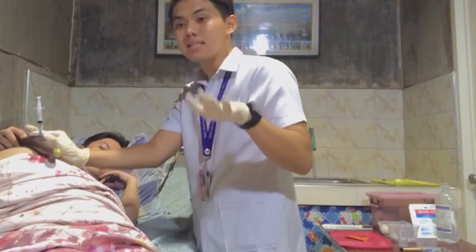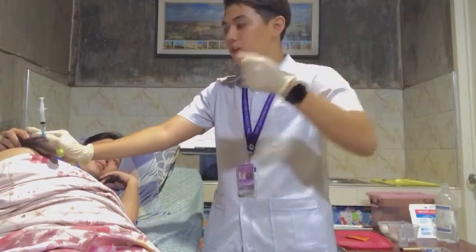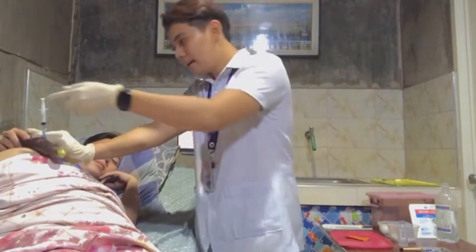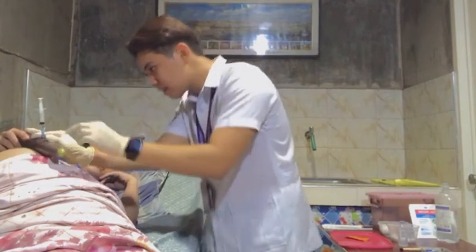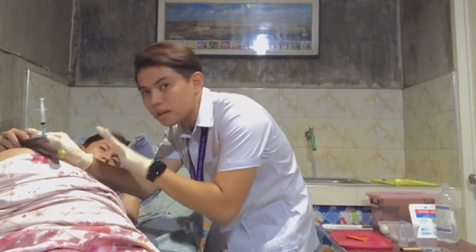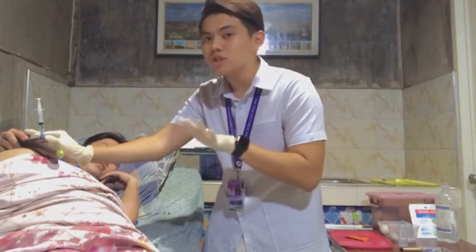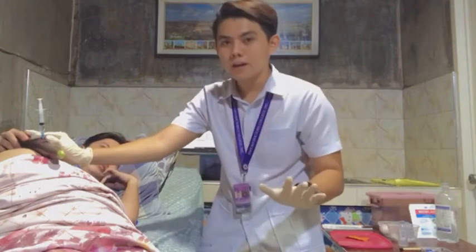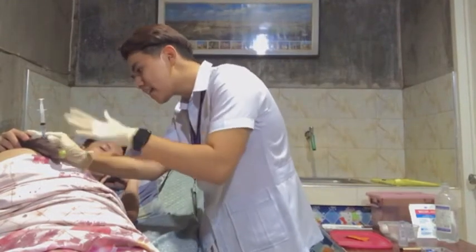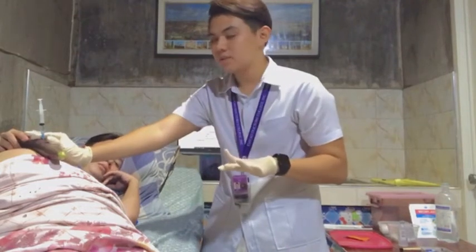We need to aspirate the syringe by pulling back the plunger with your dominant hand. As you can see, no blood appears. But if blood appears, you are not in the muscle and you need to remove and discard the needle and syringe and start over. Since no blood appears, we can proceed to the next procedure.